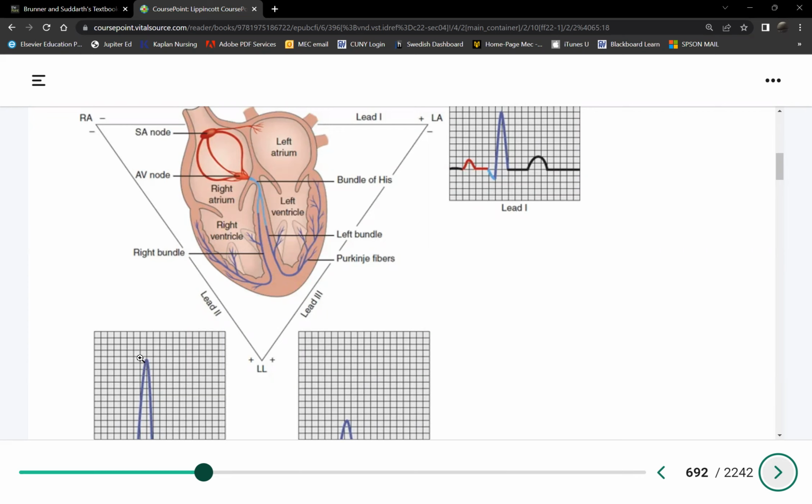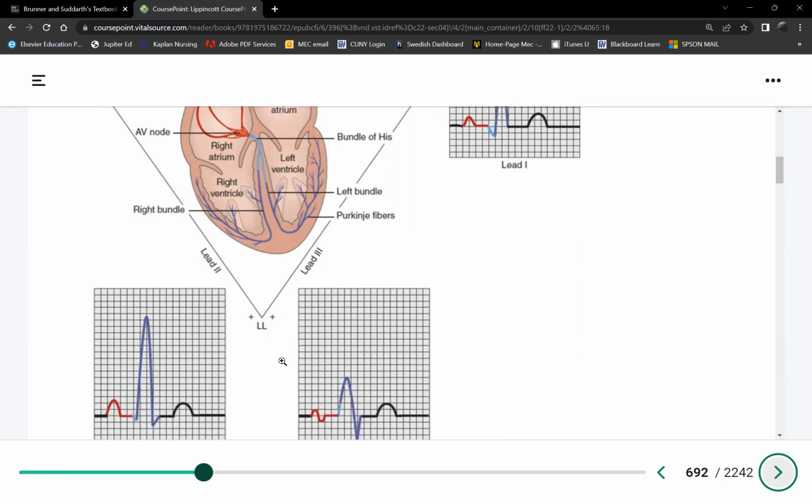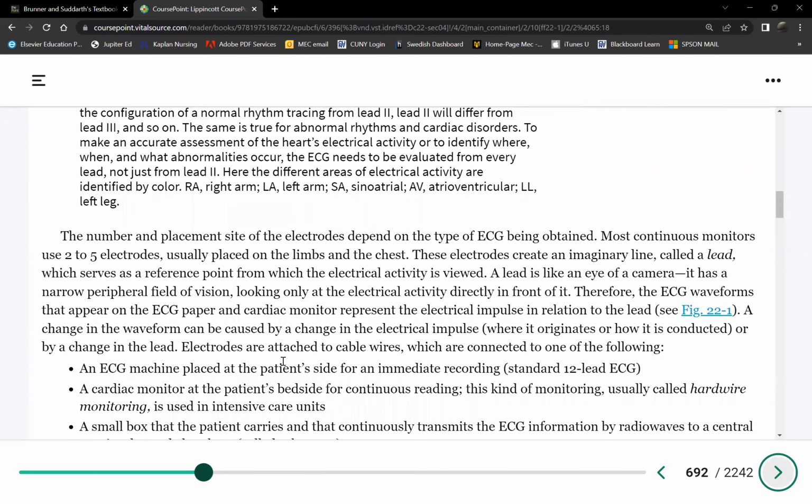So that electricity will pass through the circuit, because otherwise it will go into the ground, correct? All right, so that's the purpose of the right leg here, because we're going to put a lead on the right leg. The right leg is simply a ground lead. Okay, so it's only the left leg that carries electrodes, both positive.